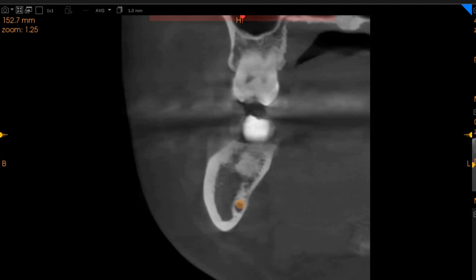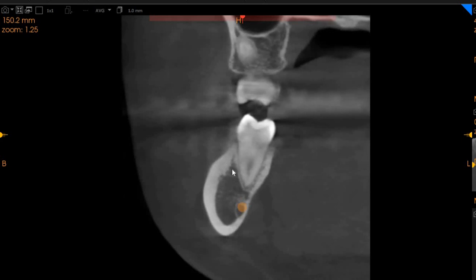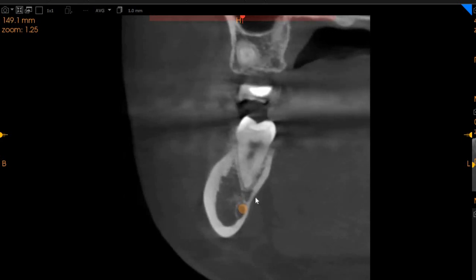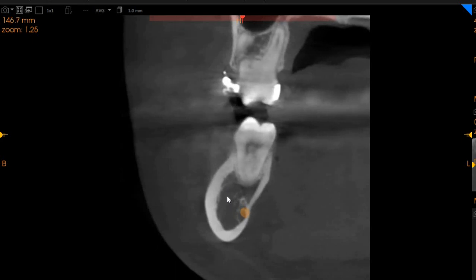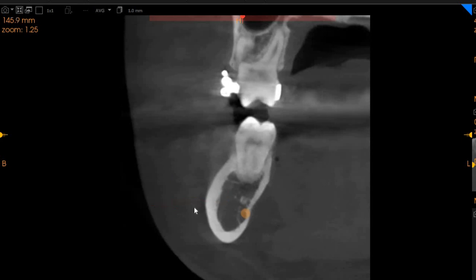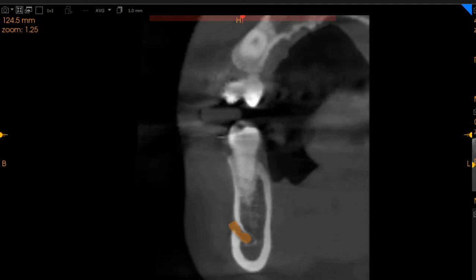Here also you can very clearly see we have another lesion where there is significant radioopacity, and associated with that we see areas of very radiolucent cancellous bone. This cancellous bone is not as radioopaque as we would have expected it to be, so contrasting with the radioopaque lesions, this area presents to be more radiolucent.